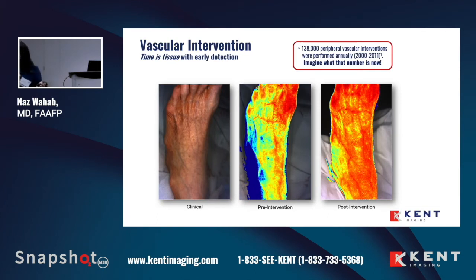Vascular intervention, once again, you know, the skin is an organ. And so are we getting end organ perfusion is really what's interesting. And I think it should be utilized in addition to post-intervention imaging. So here we can see there are no wounds here. This is a clinical claudication that the patient was coming in with.